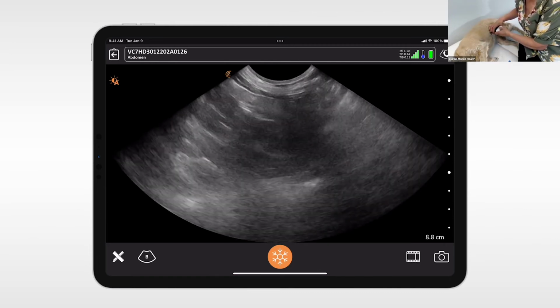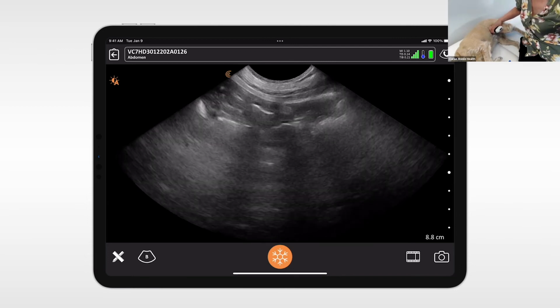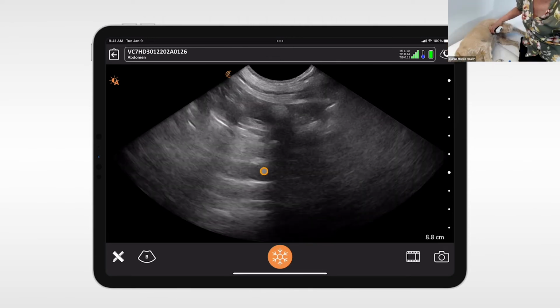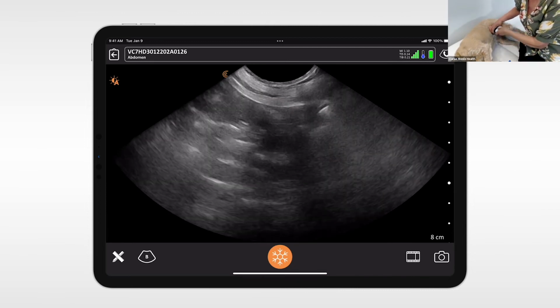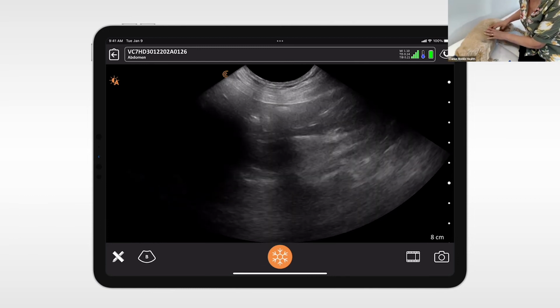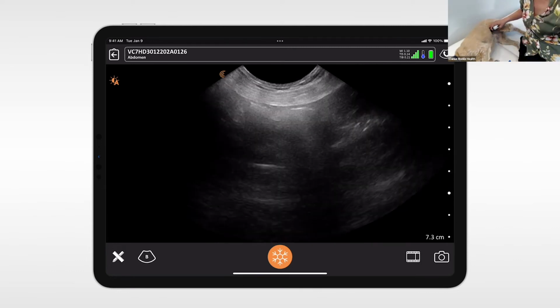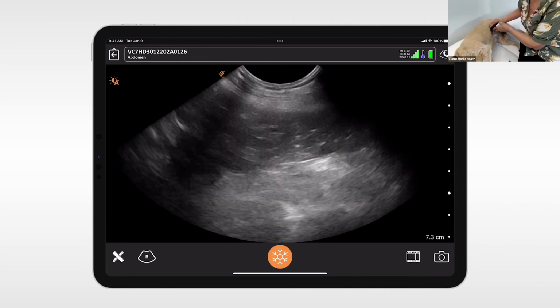So I'm just starting up by where you said, the left kidney here. She's pretty gassy. She's had lots of treats at the office today. Yeah. So we want to look about where the right kidney is, looking up towards the spine to look for the aorta. I think I'm starting to see it right here. Yeah, that aorta. Okay, so I'm just going to do a little swipe here and try and get that lengthwise. I suppose fasting your patient makes it easier if you're going to do the scan. Exactly. Gas can really get in the way of scanning anything in the abdomen, really, but particularly lymph nodes, particularly the jejunal lymph nodes. It can really get in the way.